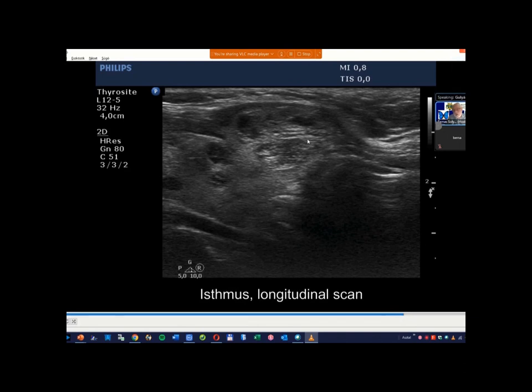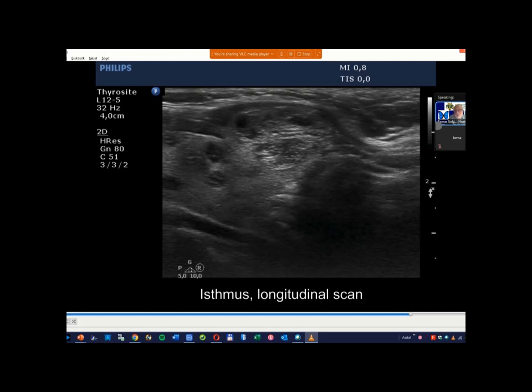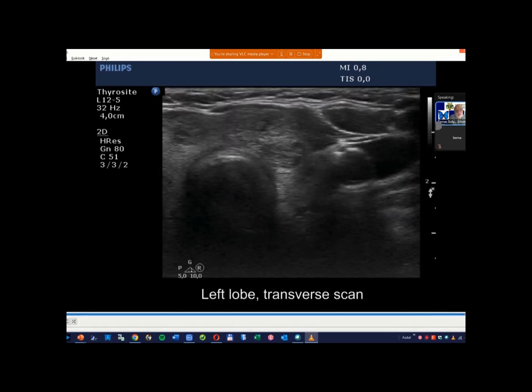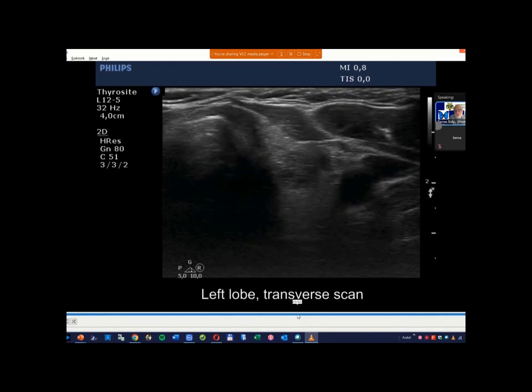Yes, but I don't think that this would be a great problem if someone says that this, for example, corresponds to connective tissue, because here is no cystic area. Here, before this line, we can see tiny cystic areas. Here we can guess, here it is clearly, but regarding that and this line, we cannot see cystic areas. It is not a problem. The issue is not to mix up these forms with microcalcifications.